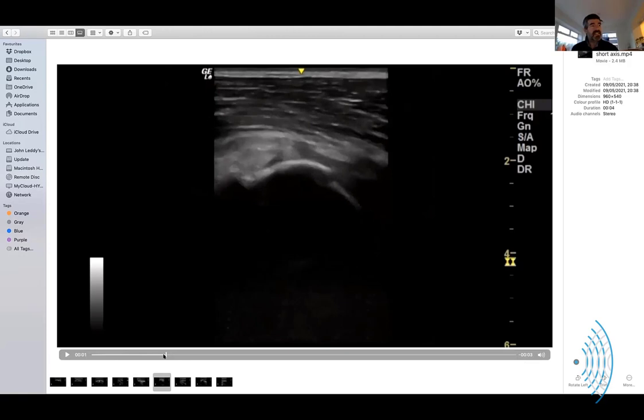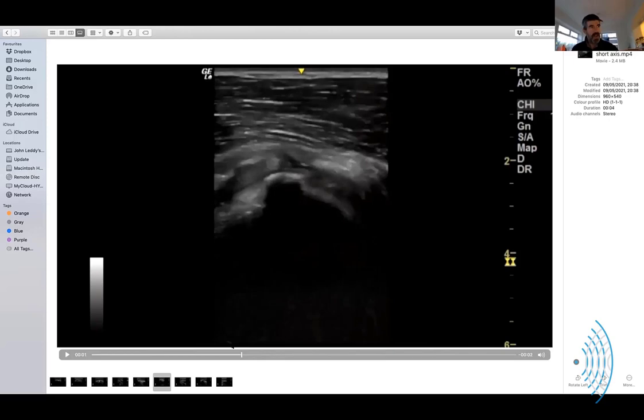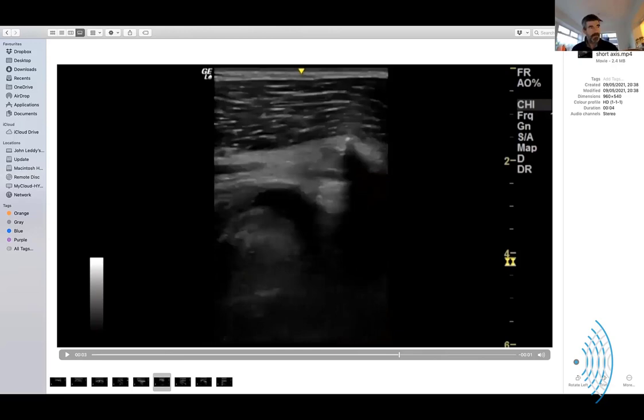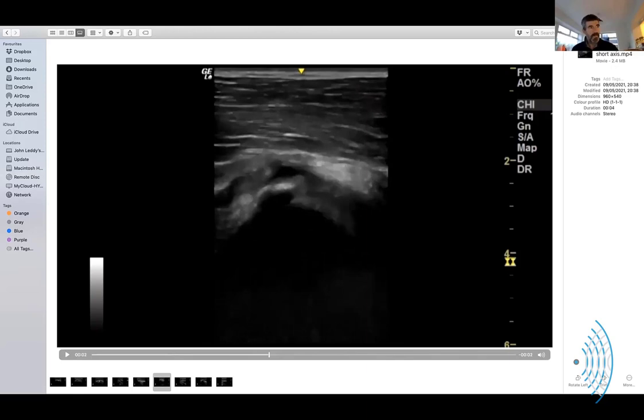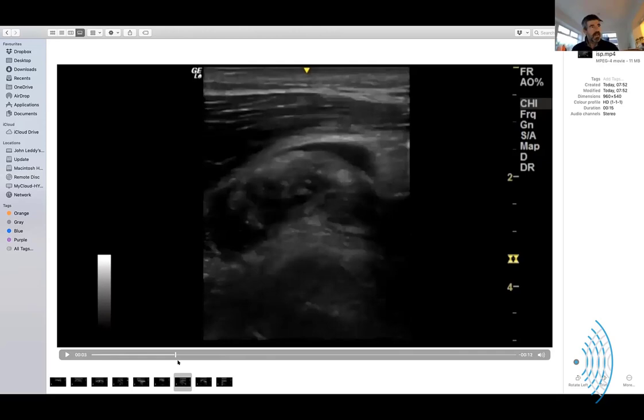This is, again, actually the short axis. This was a weird one. I could not get a decent picture of this, but this is his subscapularis in short axis. I could not get his arm round very far to see it, but this is all that's left of the tendon, as far as I can make out, just this bundle. Is that periosteal echo at all indicative of a cleft or a lifting of the structure at all? I wasn't sure. This was a very messy shoulder. Okay. And I was in full guessing mode. That's where I live, John. Yeah, that's my playground.